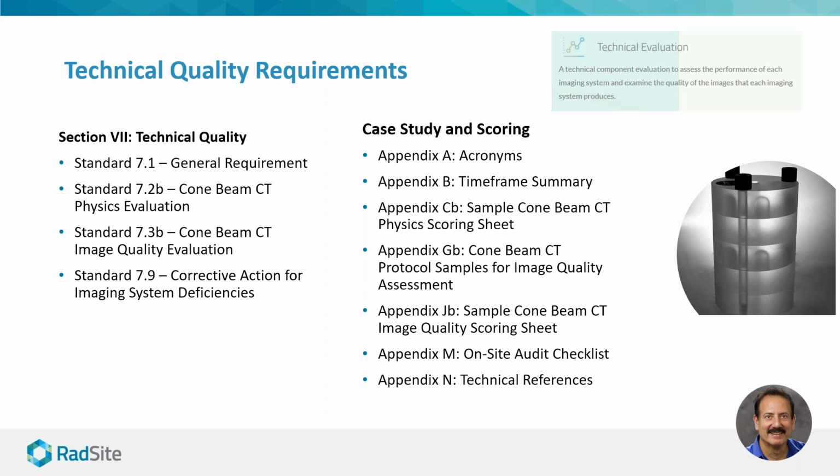Yeah, thank you, and thanks for a great overview. I think this is probably a good point to underscore the fact that ConeBeam CT is very different than non-ConeBeam CT, and that there are fairly unique requirements with regard to assessing quality, looking at radiation dose, and looking at the physics. The method of acquisition is substantially different for ConeBeam in comparison with non-ConeBeam. And so that makes it particularly important to look at the technical quality.